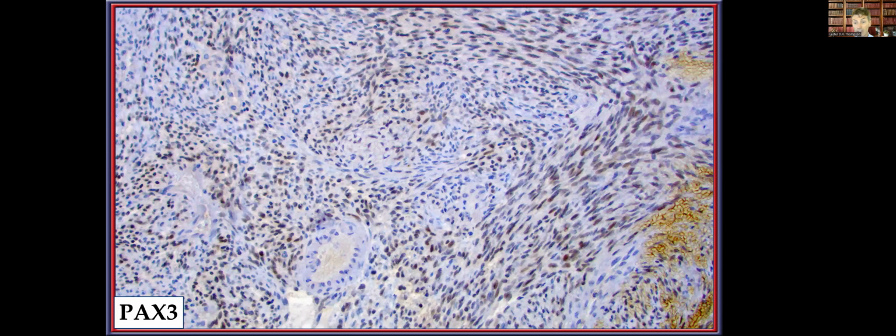And this is an example of PAX3. Well, yeah, I know, it's kind of a pathetic stain. I mean, it is positive in the nuclei, but it is a very difficult stain to get to work correctly. There are some commercial labs that will offer it, but just be aware it can be performed, but you really must know how to interpret the result.